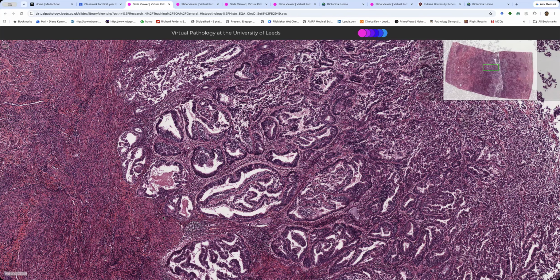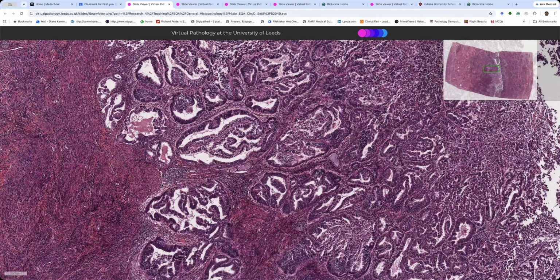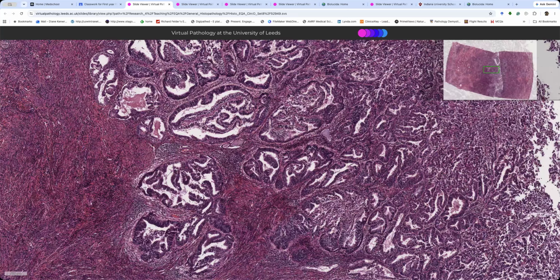Okay. So is the difference between atypical hyperplasia at the bad end different? No, it's not. So it's nice to get it right and apply consistent criteria, and you will find them written in the textbooks. It looks the same as this very complex gland here and this desmoplasia. There's something that's not in the textbooks, and that is context.